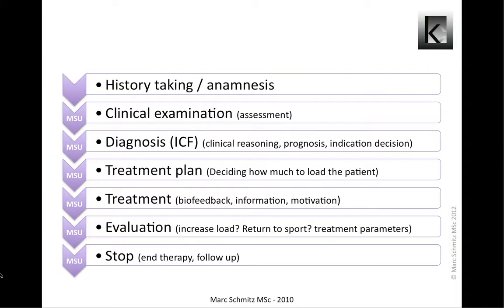MSU, both diagnostic as RUSI, can assist the physiotherapist in almost every step of treating a patient. Of course, only if there is an indication for the use of ultrasound. Click the pause button and study this flow chart closely before proceeding with the presentation. More information about this flow chart will be given in part 2 and 3.